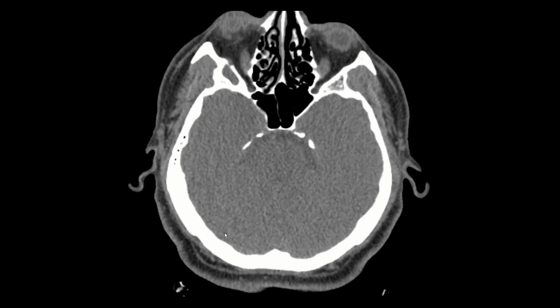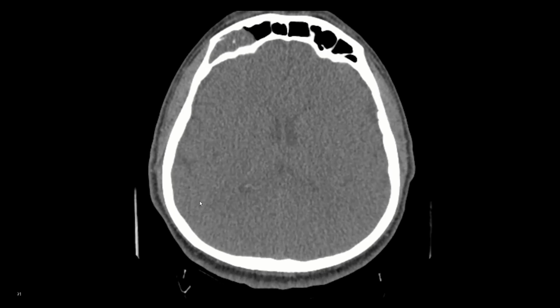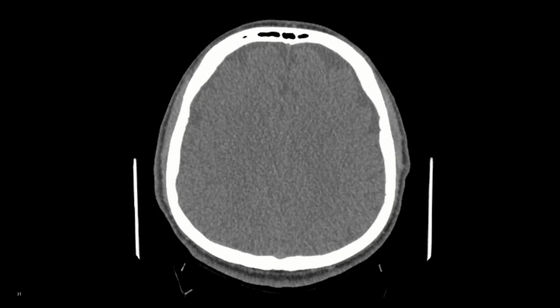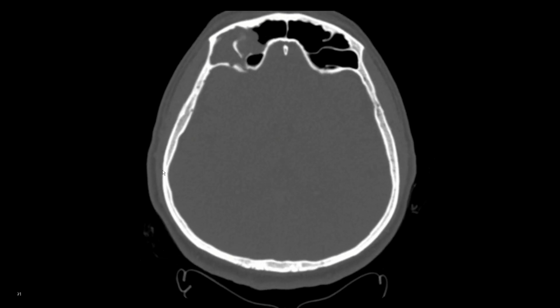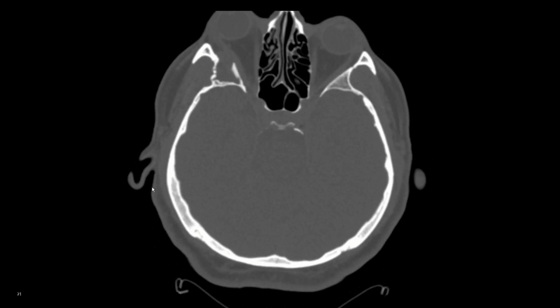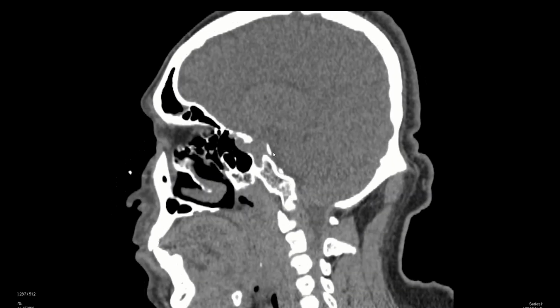This is a video of a patient in his 30s with expansile mass in the frontal sinus extending into the orbit with proptosis on the right side. These are axial images showing dehiscence along the floor of the right frontal sinus.